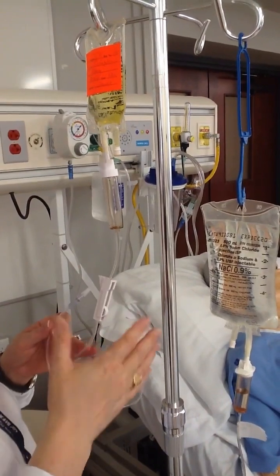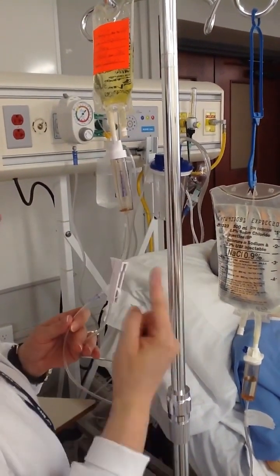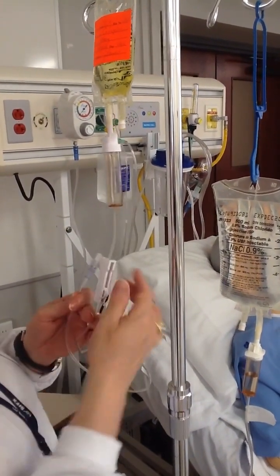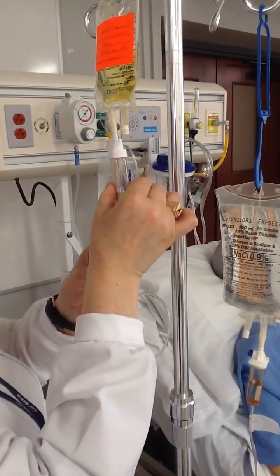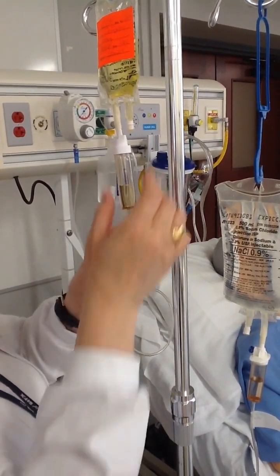The trick to a good prime is to go slow. If you open everything up too quickly, you'll get a turbulent flush of fluid, and that creates bubbles in your tubing. So just take your time, and I want you to watch first. I'm going to fill that chamber, and you do that simply by squeezing the chamber, and then just let a little bit of fluid come in there. Okay, that's enough. We're going to count the drops from there.